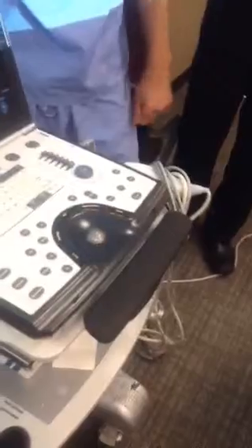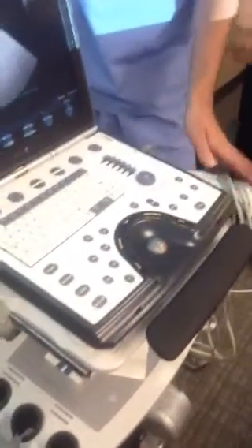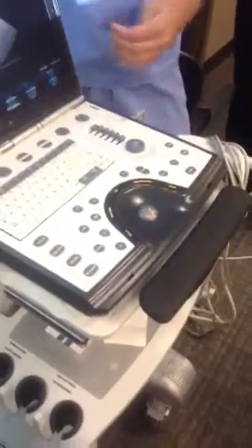And then how much does it record like this? So it's set up to record a one beat loop each time you do it. Alright. So it's only going to record one beat at a time. That's why you have it hooked up to the EKG, so it knows how much to record.